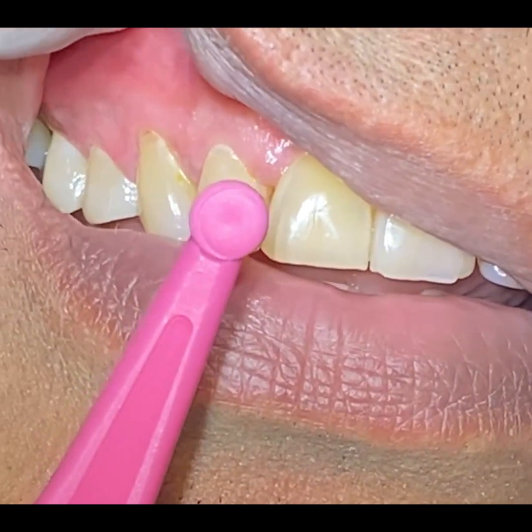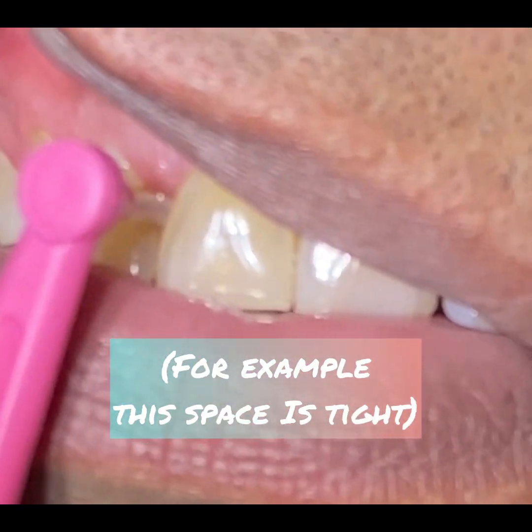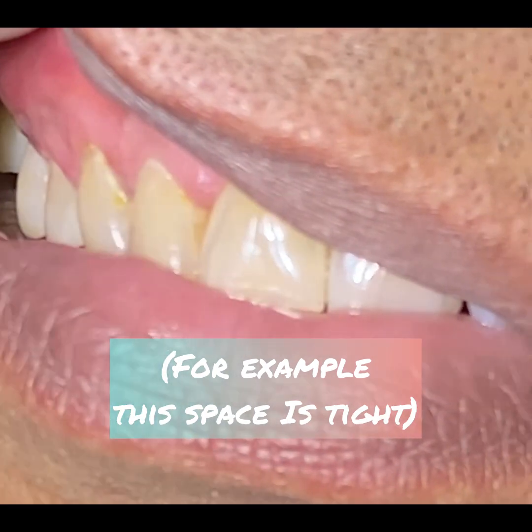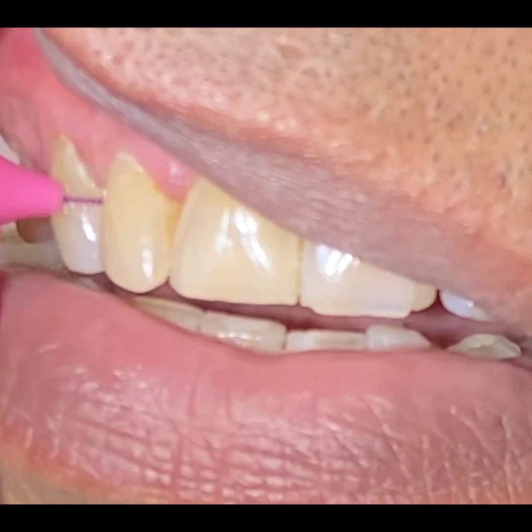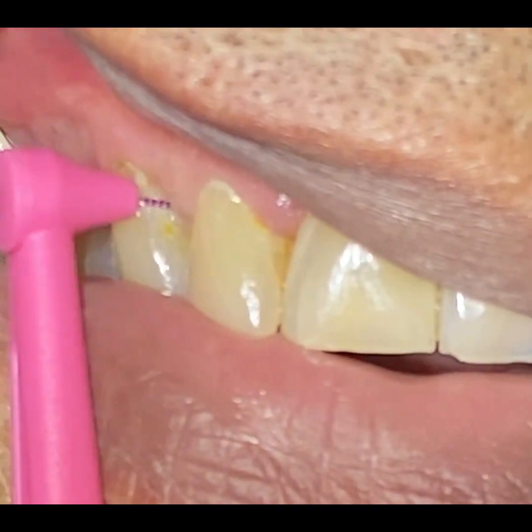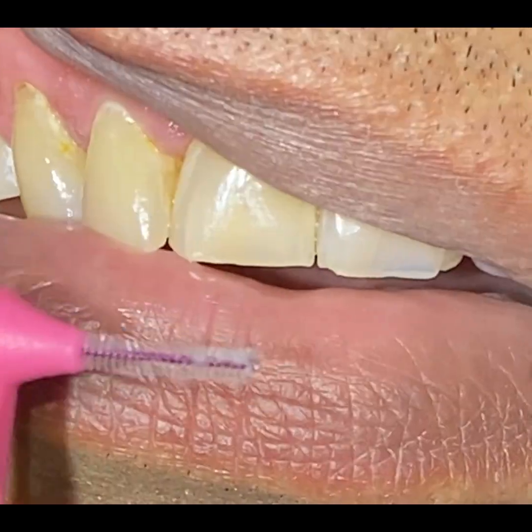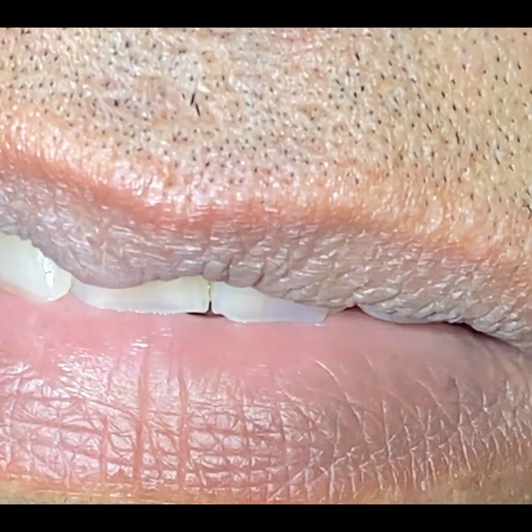Same as floss, the interdental brush will go into this space, right? If it is not going, then start using floss for the time being. Now, here, it goes in. Here, what you do is, you go below the gum. Now do it like this. And bring it out. Now look, how much material has come out. So this is very essential along with the flossing.